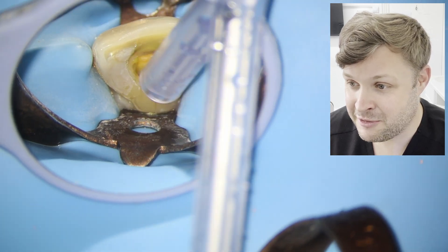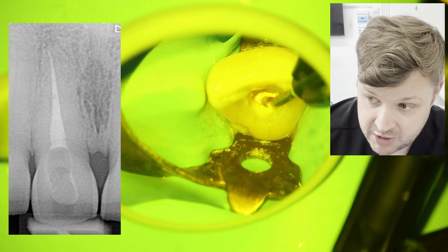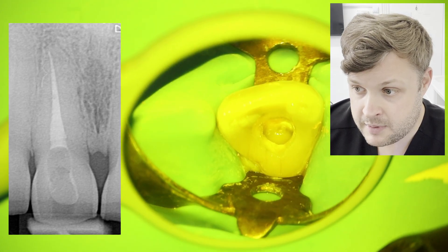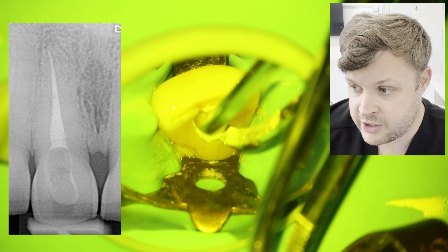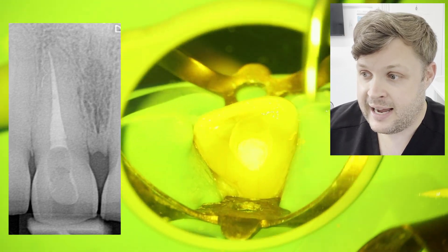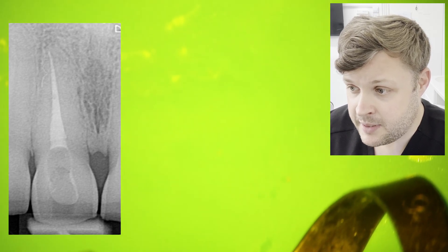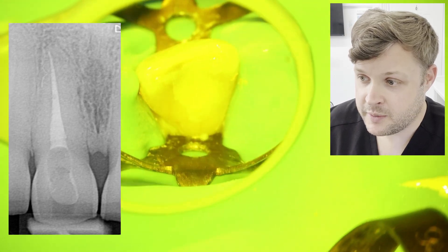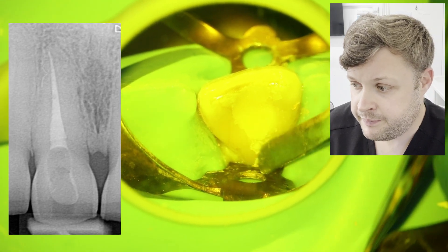So as we can see here, this is the post-op. There's a very small void, but I'm actually really happy with this. I'm happy with the apical third — it's nicely to length. Here I'm preparing the tooth for internal whitening, so I've put the composite cap over the GP and then I'm filling it with PTFE and a little bit of GI over the top. Overall, very happy. The patient was super happy. These cases have a really nice 'job well done' factor — very satisfying.